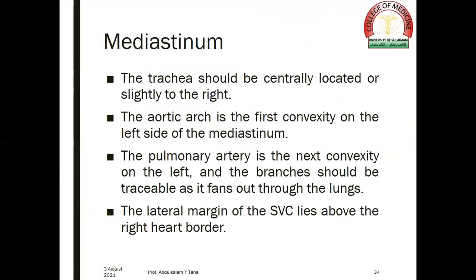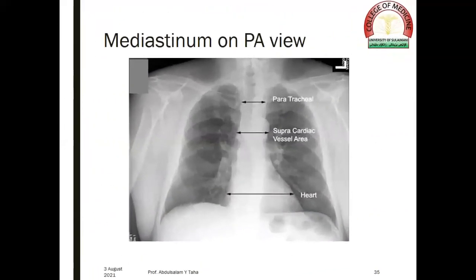The mediastinum: the trachea should be centrally located or slightly to the right side. The aortic arch is the first convexity on the left side of the mediastinum. The pulmonary artery is the next convexity on the left, and the branches should be traceable as it fans out through the lungs. The lateral margin of the SVC lies above the right cardiac border. These are the main measurements of the mediastinum.